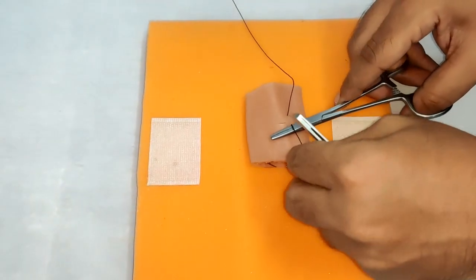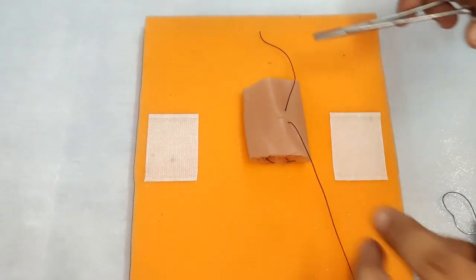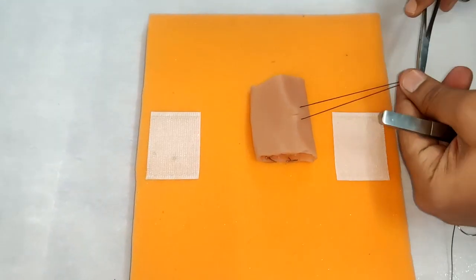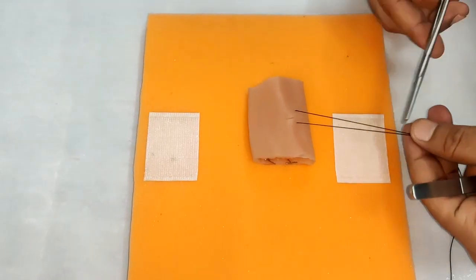But here we will not be tying the knots and instead we will hold the ends with an artery forcep and we will cut the thread.